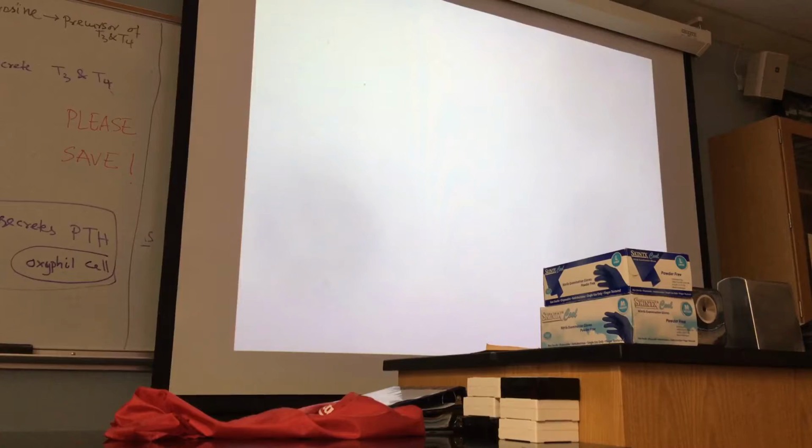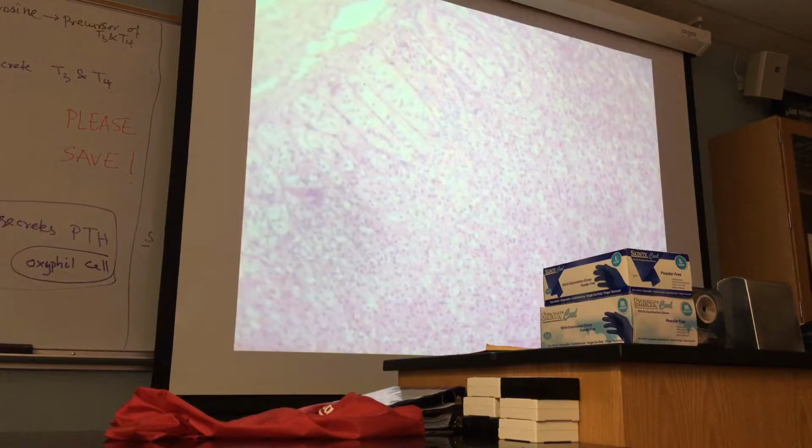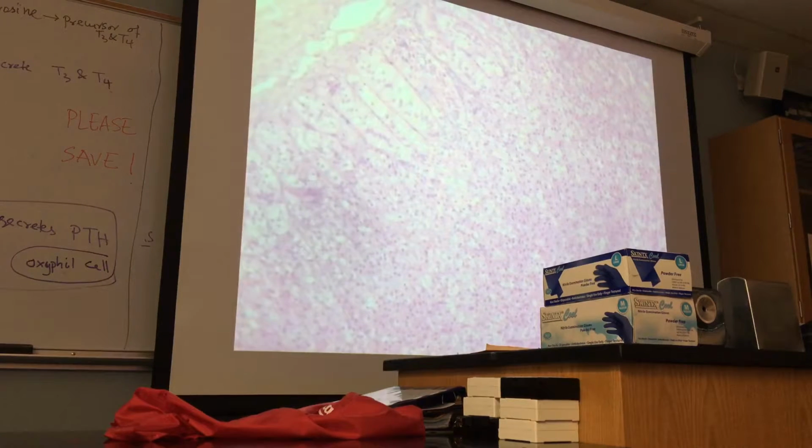I would like you to go to diagram number. It stands out. Oh, come on. They look like mini hot dogs.